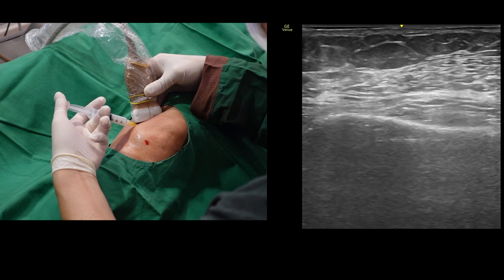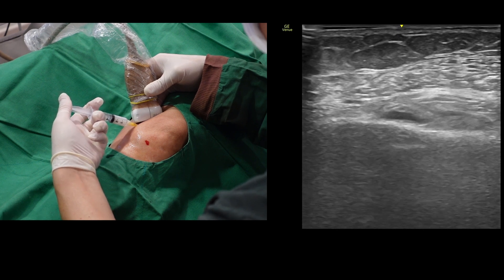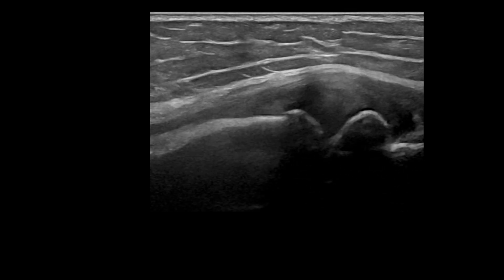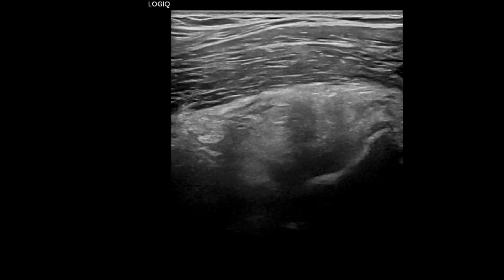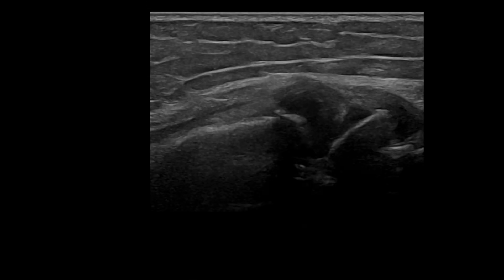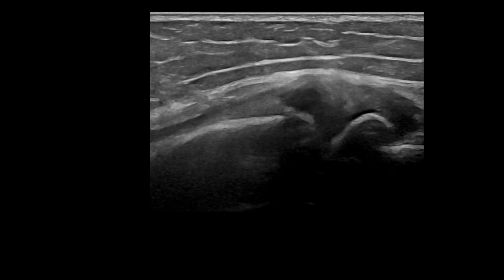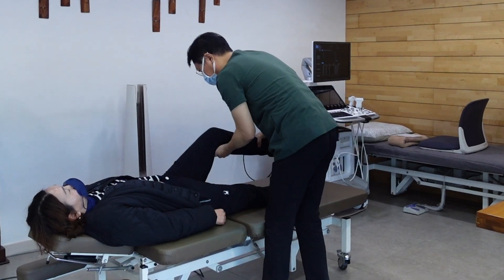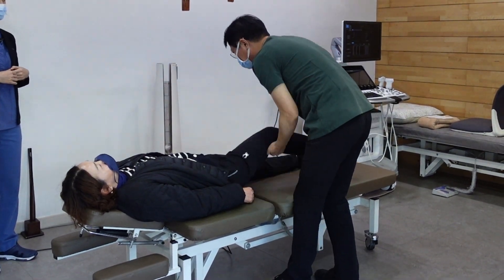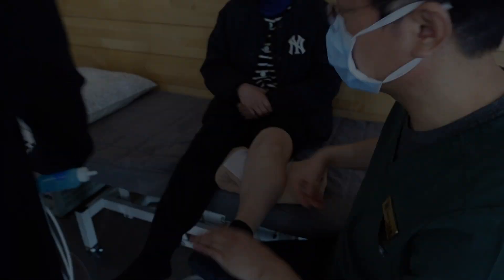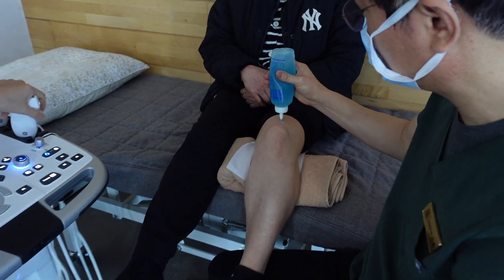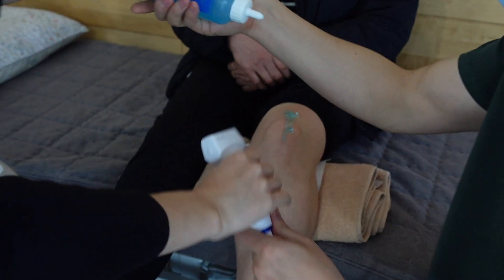Ultrasound offers a more valuable tool for guiding injection procedures than as a diagnostic tool in the knee joint. However, ultrasound has its advantages in diagnostic value, including interpreting the collapse of the meniscus, assessing the degree of bulging, evaluating the posterior portion of the anterior cruciate ligament through a posterior window, and observing protective forming marginal osteophyte. It adds value when combined with background knowledge such as pain location, pain intensity, and basic physical examination. So let's begin with the basic ultrasound scanning techniques and add some tips to modify your viewpoint. Prepare to be amazed.